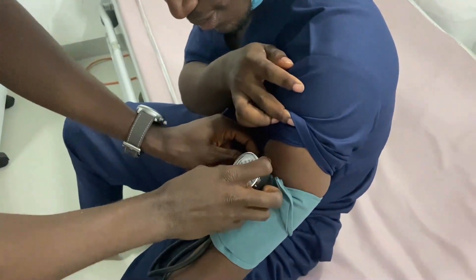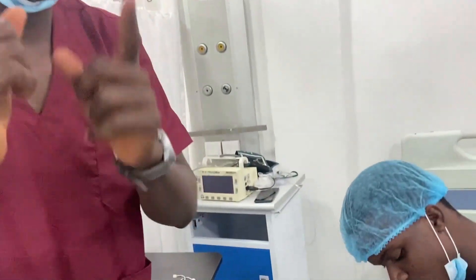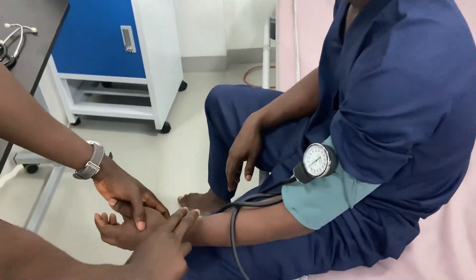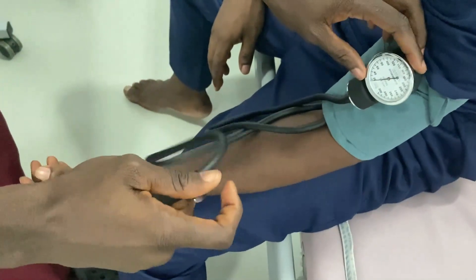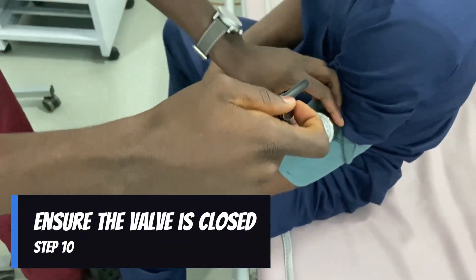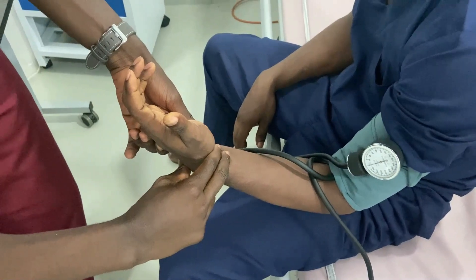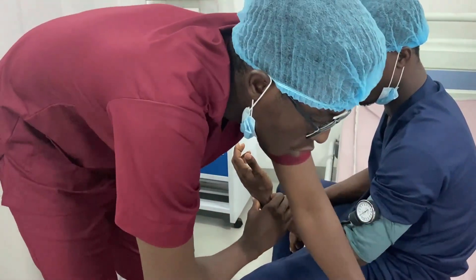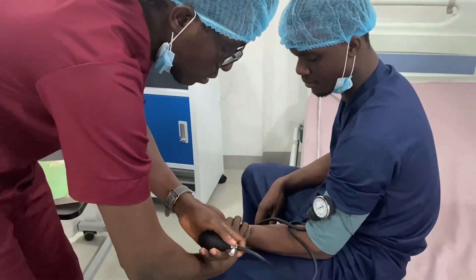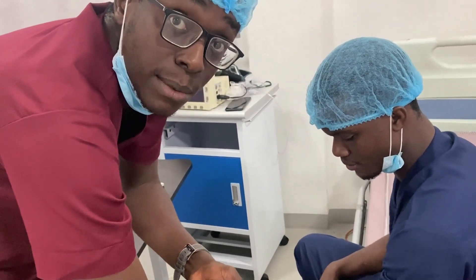Note that the mercurial sphygmomanometer is the most accurate sphygmomanometer. Make sure your valve is closed. Then find the radial pulse. Once you have the radial pulse, inflate the cuff. Inflate to the point where you can no longer feel the pulse, then exceed by 30 mmHg.